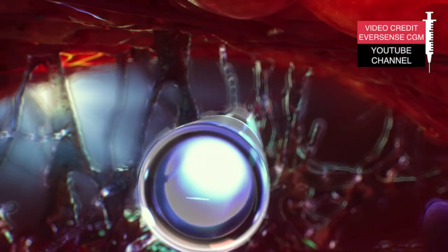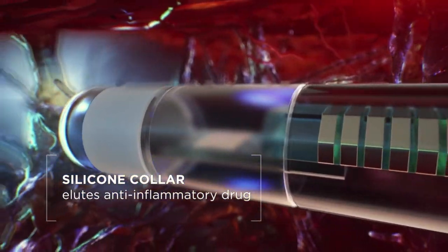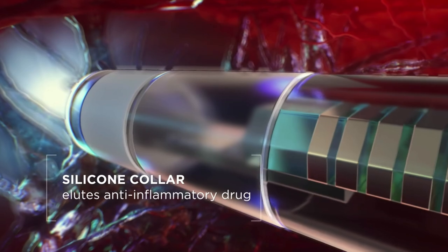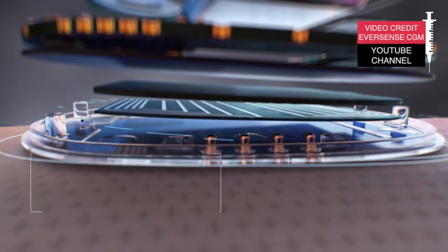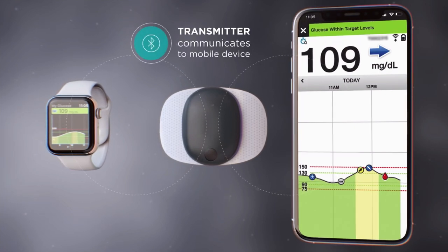The company says that any risk of potential tissue inflammation is reduced by the sensor's drug-eluting silicone collar, which helps the device maintain accurate readings over a long period. Similar to other CGMs, Eversense takes readings from interstitial fluid rather than directly from blood. The sensor communicates raw data to the transmitter every five minutes, and the transmitter immediately sends glucose readings to your mobile device via Bluetooth. The app gives you your glucose value, trend direction, and alerts when something is wrong.